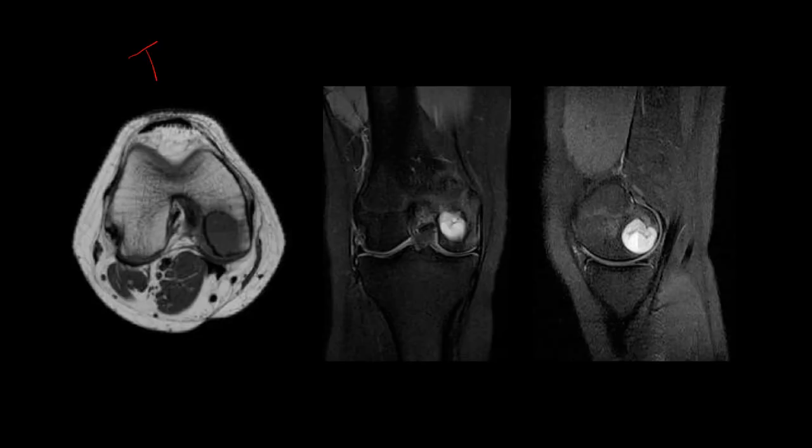On MRI with T1 axial and T2 fat-sat images, the well-defined sclerotic border corresponds to low T1 signal intensity. On T2 the lesion is well defined with prominent perilesional edema. The lesion is located in the epiphysis with some extension into the metaphysis. There is a fluid-fluid level indicating hemorrhage or two different fluid compositions. This patient has a chondroblastoma — a typical lesion of the epiphysis usually in long bones such as the humerus, femur, and tibia, most often seen in the proximal humerus.